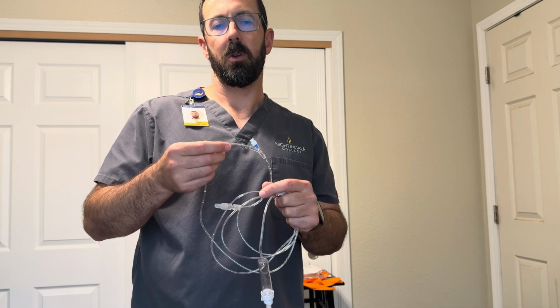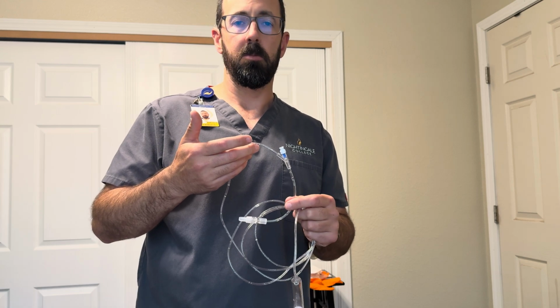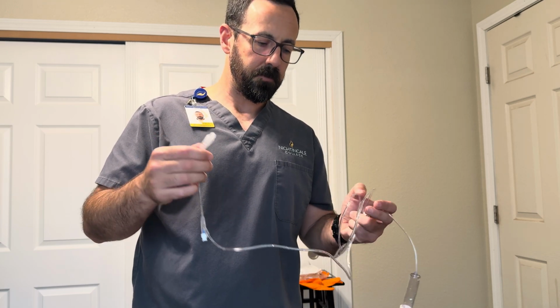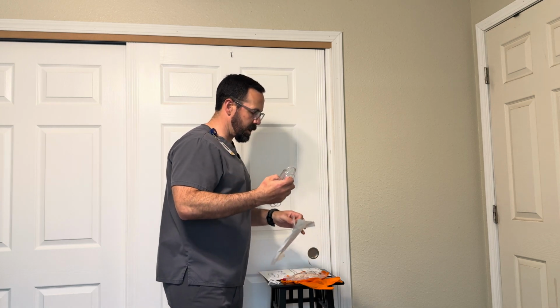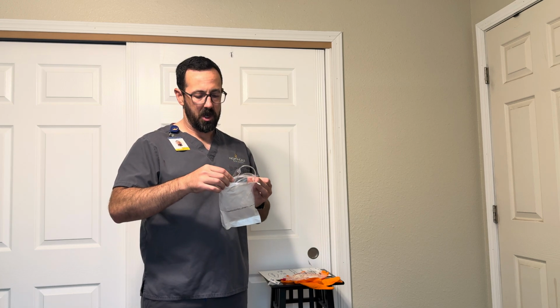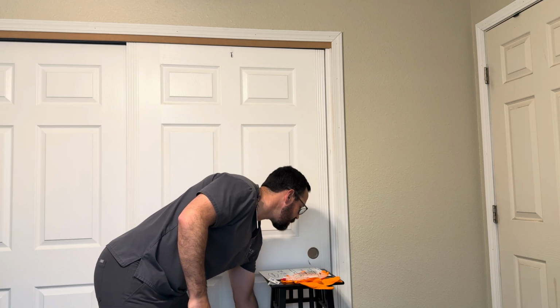This is where you would administer any medications such as a piggyback or IV medications via push. And then this is your connector to the IV site. So these would be in a sterile bag, but this has been opened for training purposes. And we'll put it here.